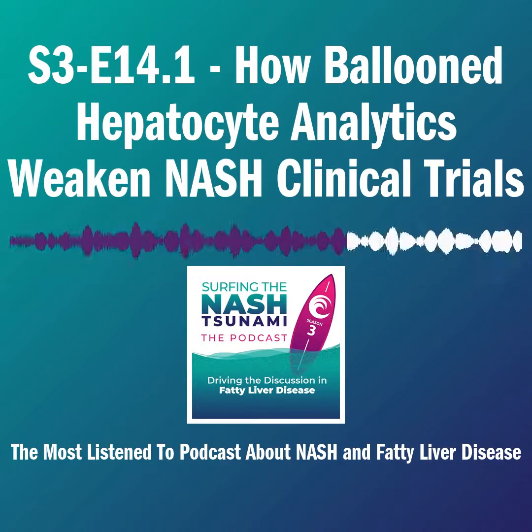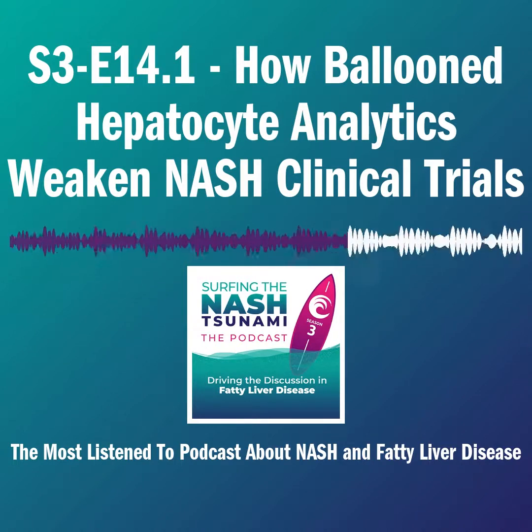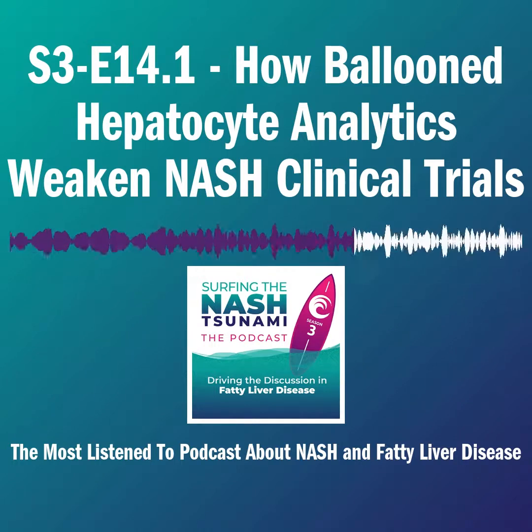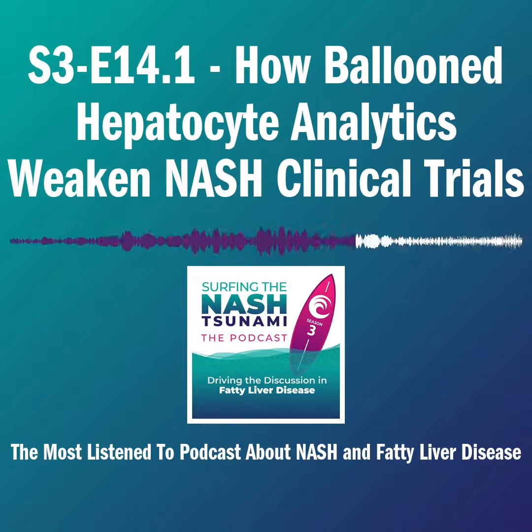And you want to say, what is unique about that cell? What can all nine pathologists take away from that cell that can go teach all the other pathologists and say, this is what we're looking at? And I think the SAF kind of gets at that a little bit. It's a bigger cell. It's not a few versus many. It's the size of the cell. I think we're beginning to unravel that, to unpack that a little bit more.